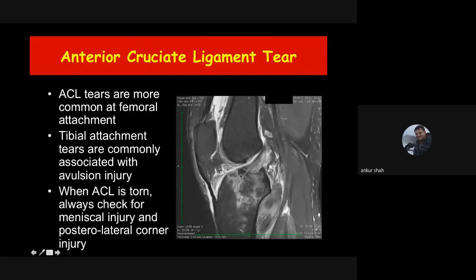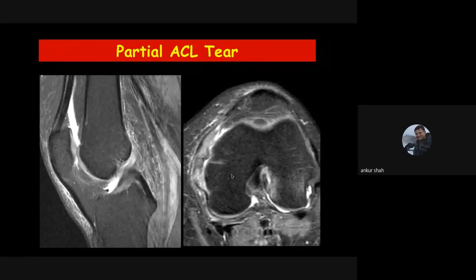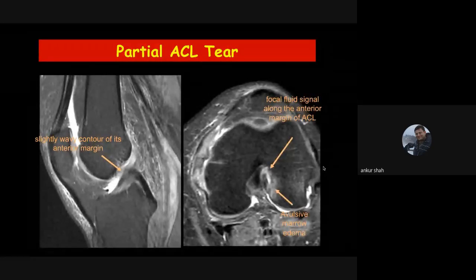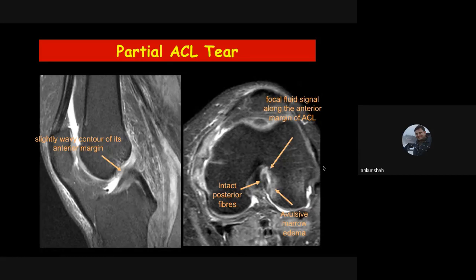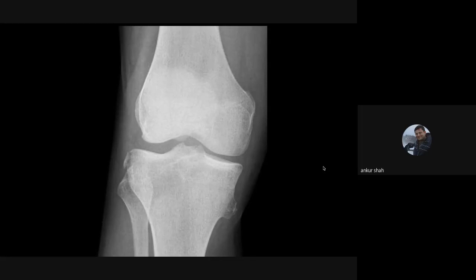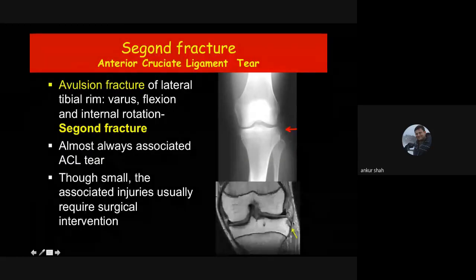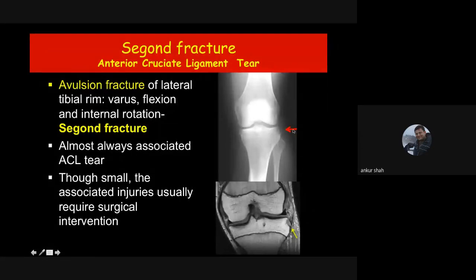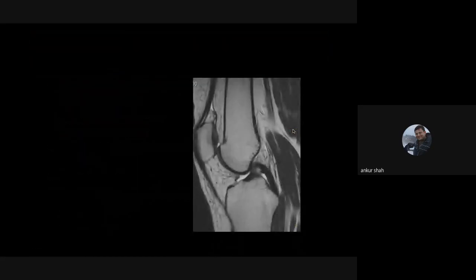Sometimes there can be a partial ACL tear — if only one bundle is torn (e.g., the anteromedial bundle is torn but the posterolateral bundle is intact), it is termed a partial ACL tear, though it is tricky to detect even on MRI. An important finding: when you see a small fracture at the lateral tibial rim — the Segond fracture — this is almost always associated with ACL tear. Do not overlook this small fracture at the lateral aspect of the lateral tibial condyle.